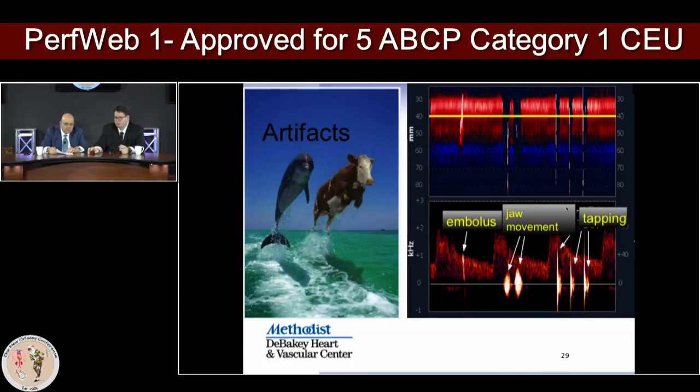It's okay. That died. So that's my first part of introduction of what you see on the TCD screen. And with my second, yeah, it's moving again. So with my second lecture, I will return and show you more live cases, how we can utilize TCD technology in the operating room.